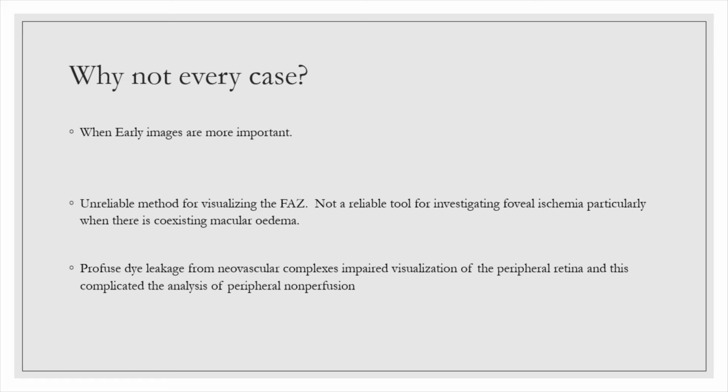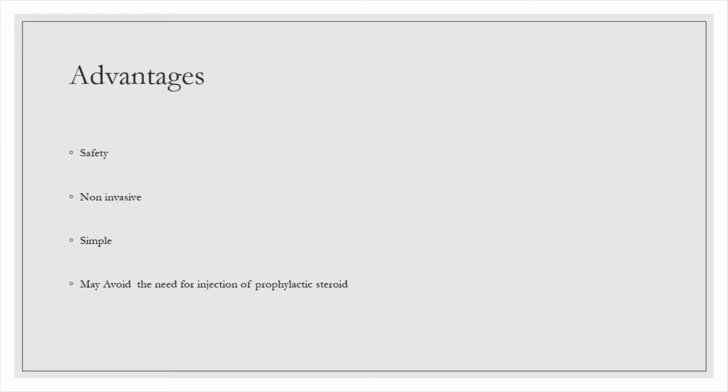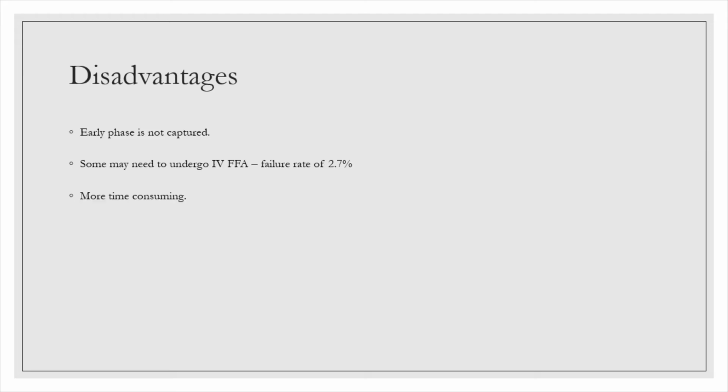But without the presence of these neovascular complexes, even CNP areas can be picked up. So the advantages are that it is safe, non-invasive, and simple, and it can avoid the need of a prophylactic injection of steroid, because only 1.7% of the cases had an adverse effect. And this is quoted in the study that I mentioned before.